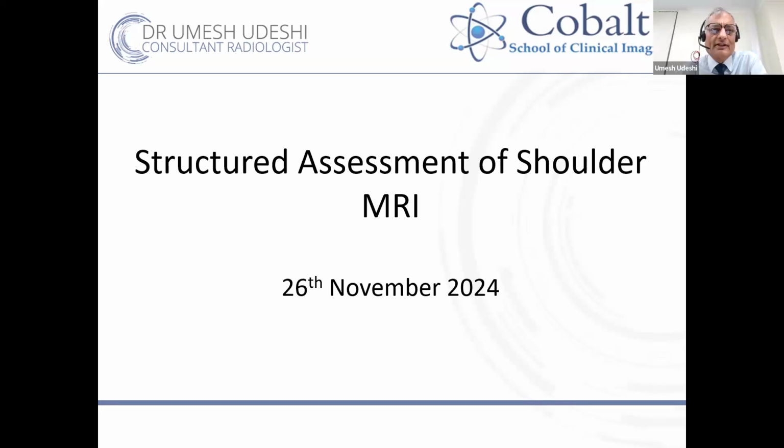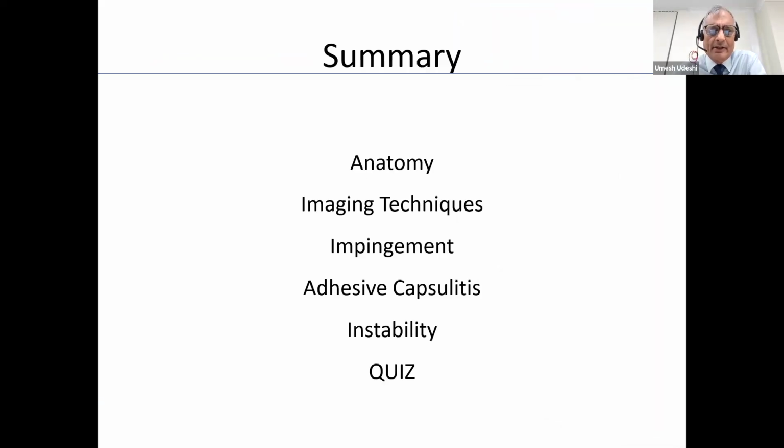Thanks very much. Thanks everyone for joining this late November evening when I'm sure you've got better things to do. So today I'm going to just talk about structural assessment of the shoulder. It's mainly a discussion of MRI, but I will touch on other imaging techniques as well.